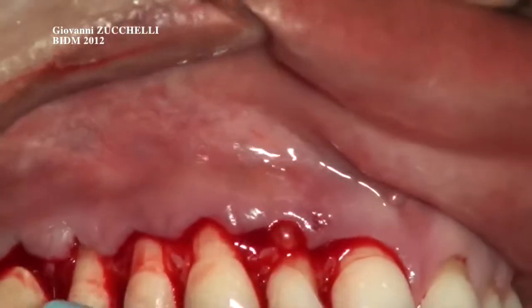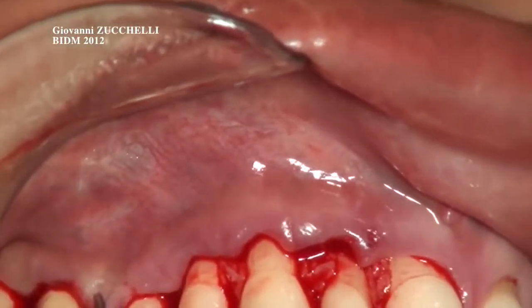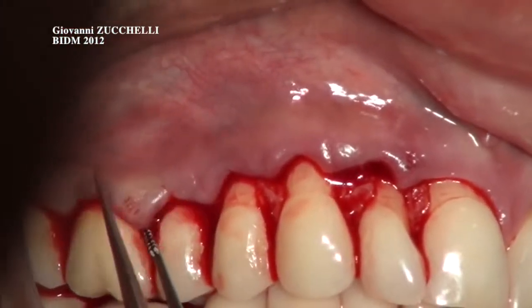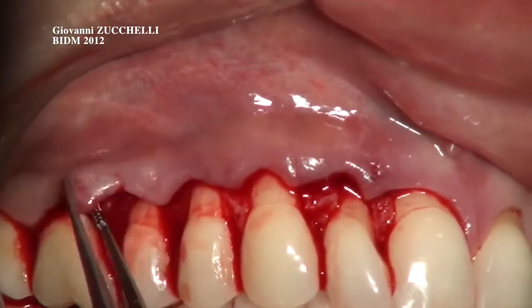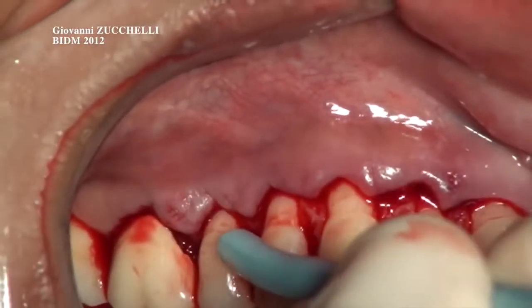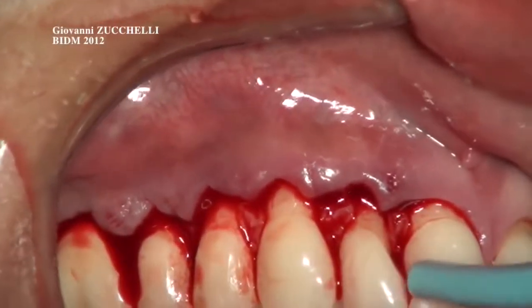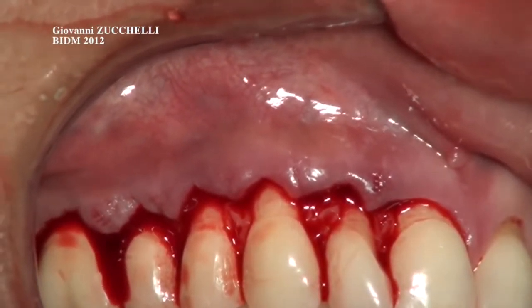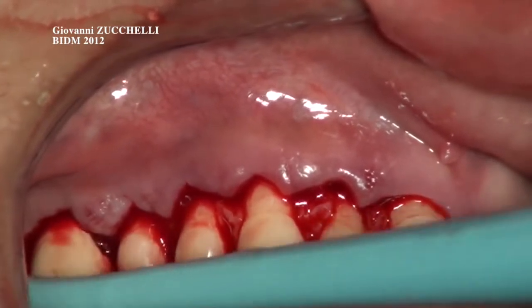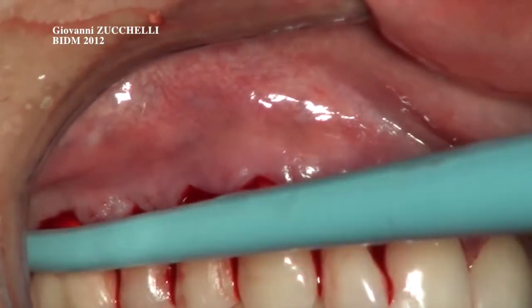The first area to be sutured is that of the molar, and this is used, please come here, to give stability of the keratinized tissue above the molar mesial root and the premolar. We use thin suturing. It's a 7-0 suture with an 11 millimeter long needle, otherwise we cannot reach the palatal aspect.